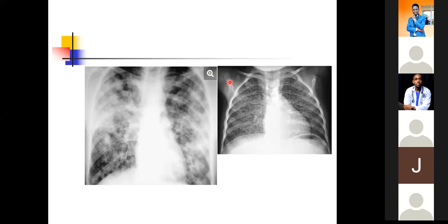So the biggest difference is in the resolving capacities of these two modalities, CT being superior to plain radiography. I think that answers your question.